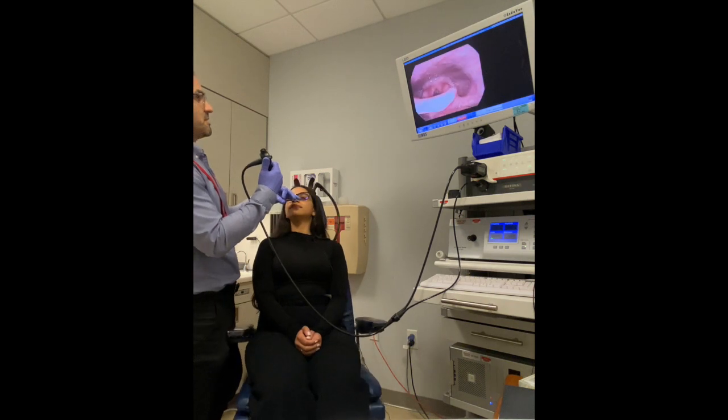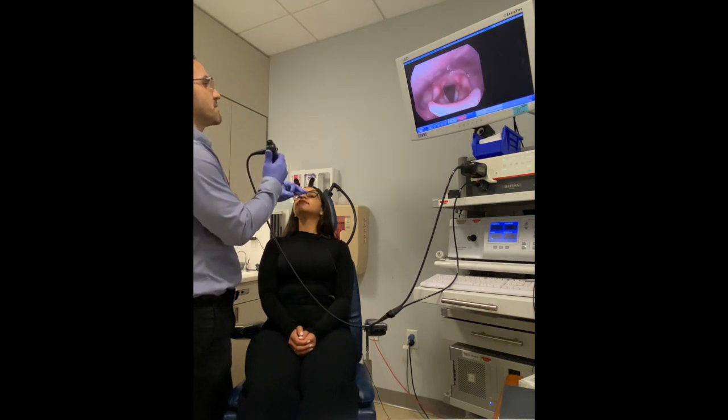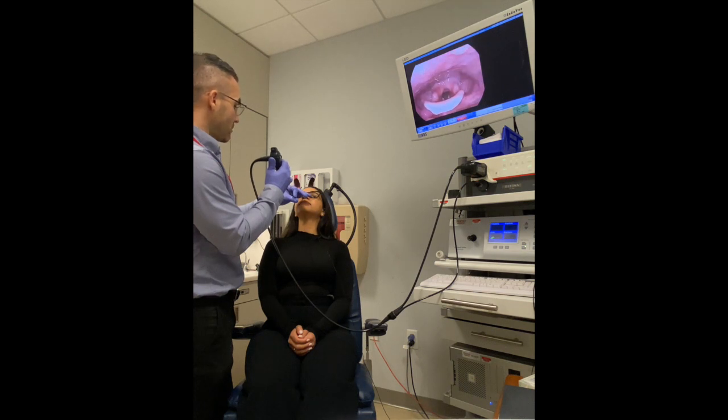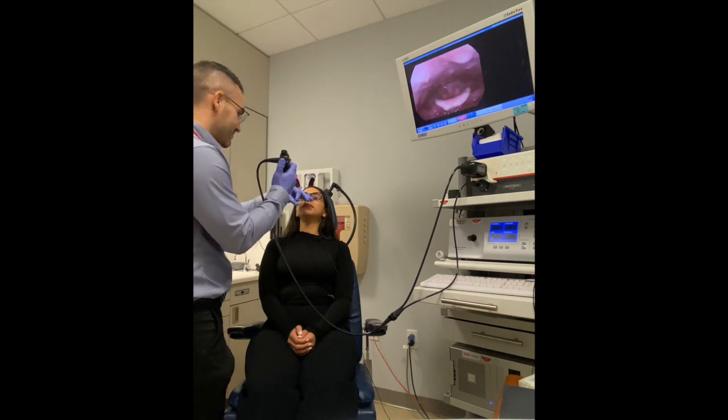I'm just going to end with a little mini assessment — the same first thing we did, the breath hold. After we do five of these, I'm going to ask you how you think you did. Lift your chin up toward the ceiling and we'll get started. Go ahead and hold your breath. Relax. Again. Hold. Relax. Again. And hold. Relax. And hold. Relax. One more. — Were any of them wrong? — I feel like two of them I put more effort. — Do you think you closed your vocal folds for all of them or only for two? — Yeah. — Exactly. This time it looks like you did them all correct. You closed your vocal folds and your sensation is pretty good. Good work.